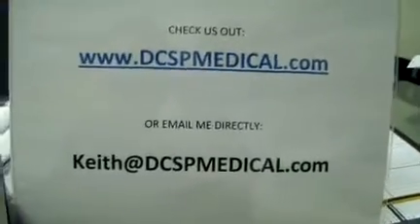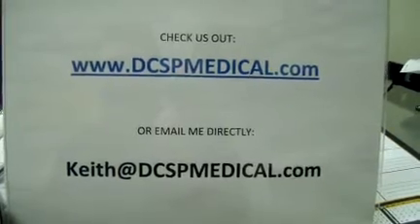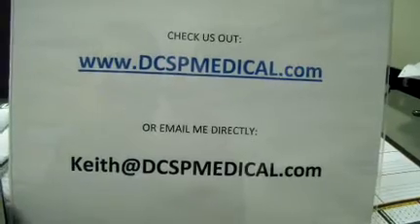It does come with a case, and that's it. If you want more information or want to see more video, you can give me either one of these ways. This was the Olympus ENF P3 Rhino Laryngoscope. Thank you.